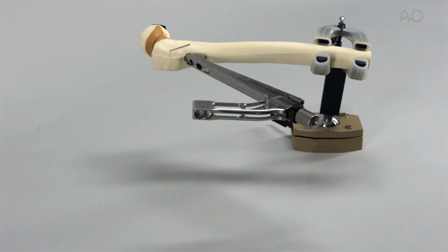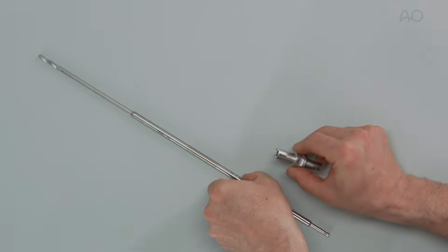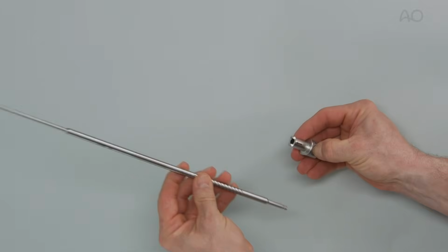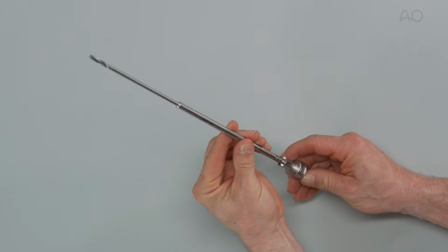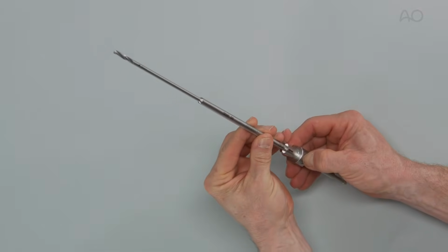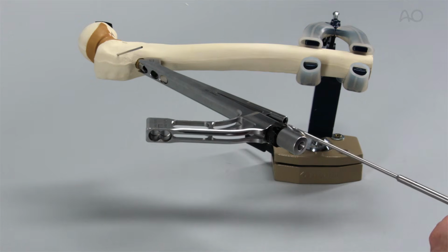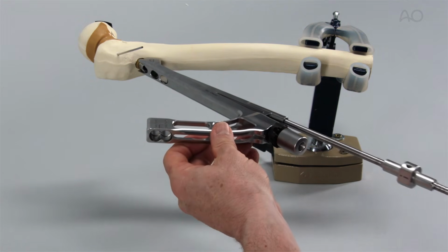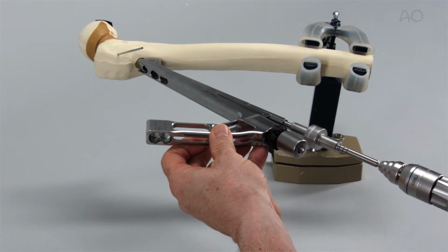The steps for an anti-rotation screw insertion will now be demonstrated. The fixation sleeve is passed over the back end of the drill bit. In this exercise, the fixation sleeve is set to 85 mm, which corresponds to the implant length and the length of the bolt. The assembly is inserted into the insert, and the hole is drilled until the fixation sleeve comes to a stop.